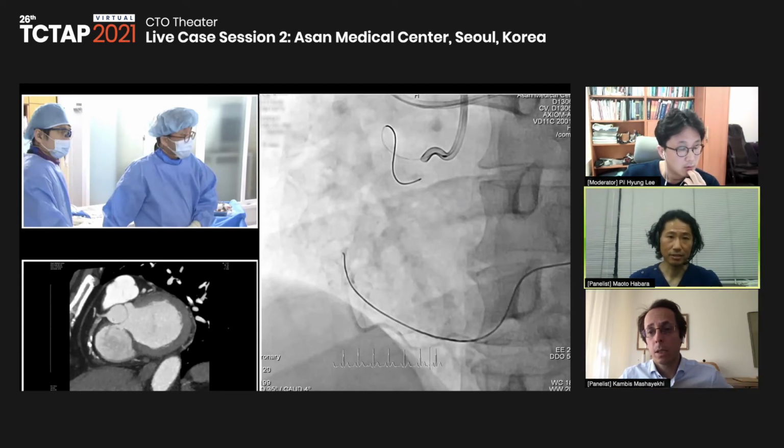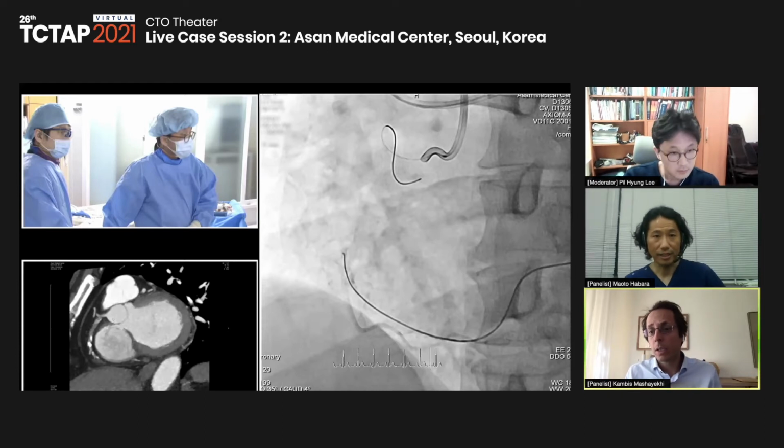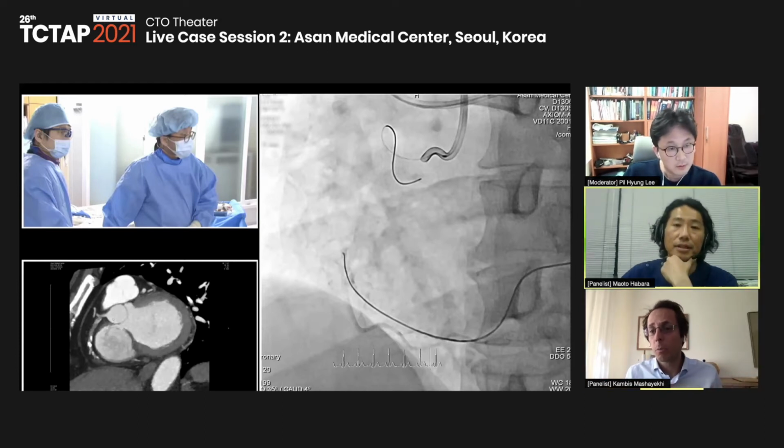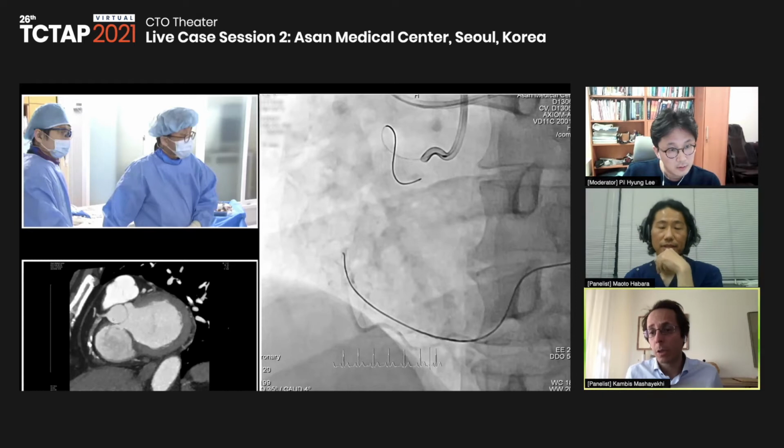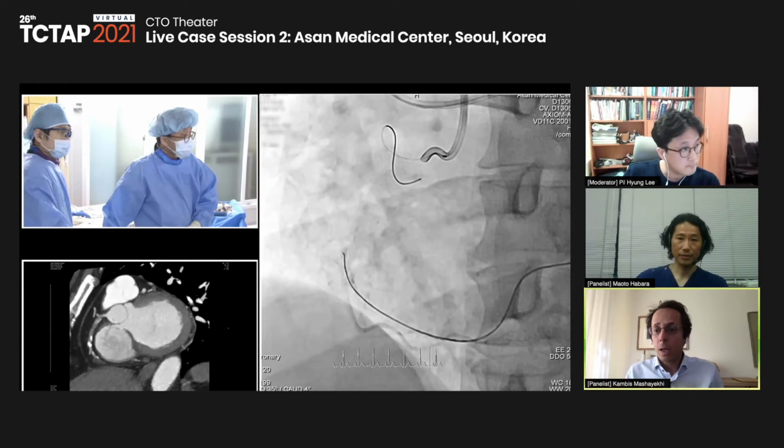So that means Progreat, for example, to have a Tornado from Cook, and in combination with a Progreat 2.7, you might be very safe. The message to the audience is that we need compatible coils for our tiny epicardials, which fit with every microcatheter, such as Fine Cross, Caravel, and Corsair Pro XS.